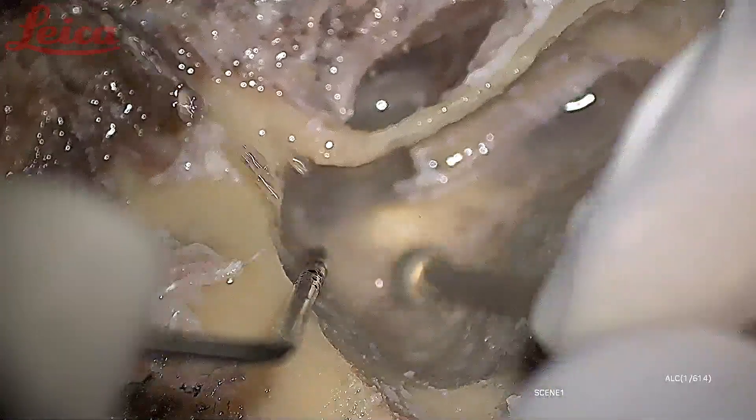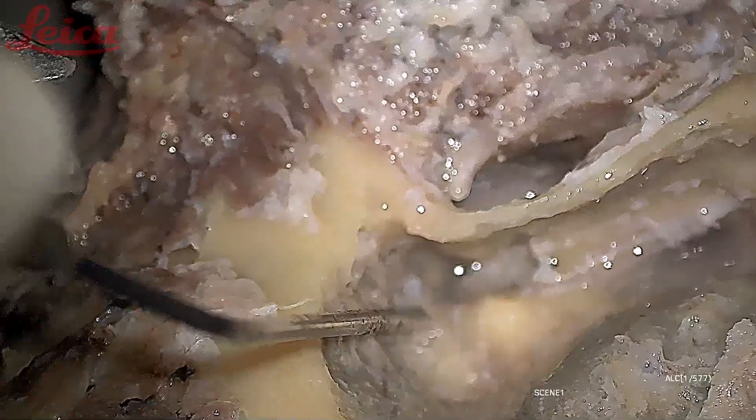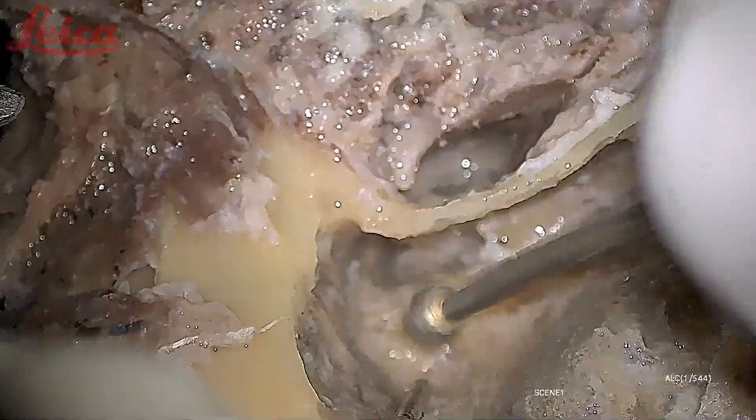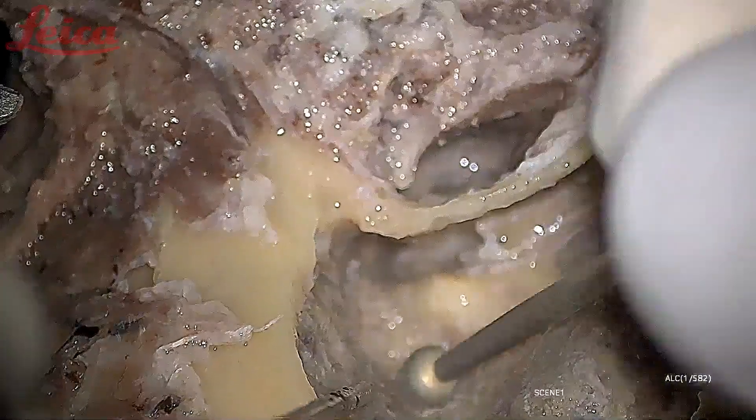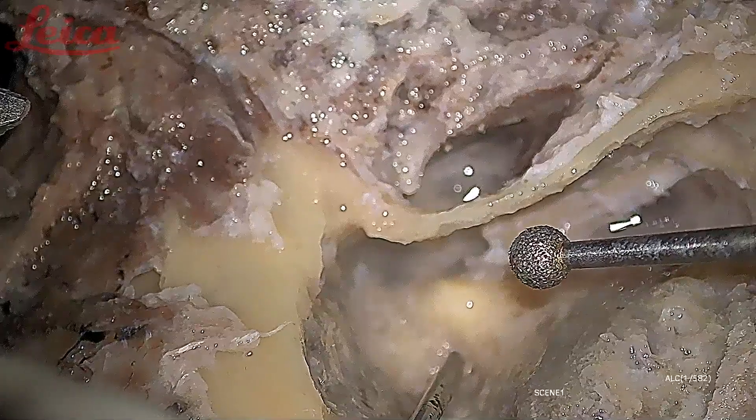The facial nerve is completely exposed now, so there are good chances it might get caught in the burr tip when I am drilling. The next step would be to delineate the semicircular canals. I think we can take a break and go for lunch together.